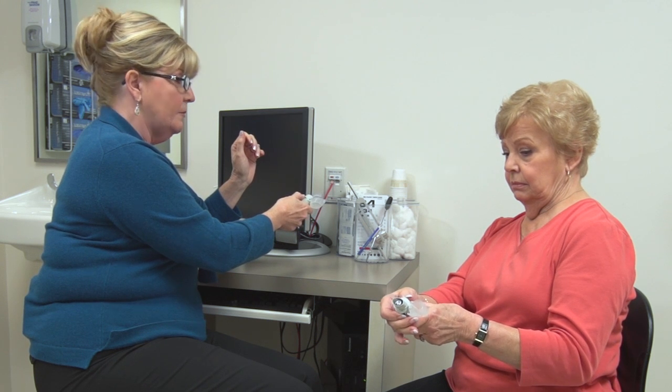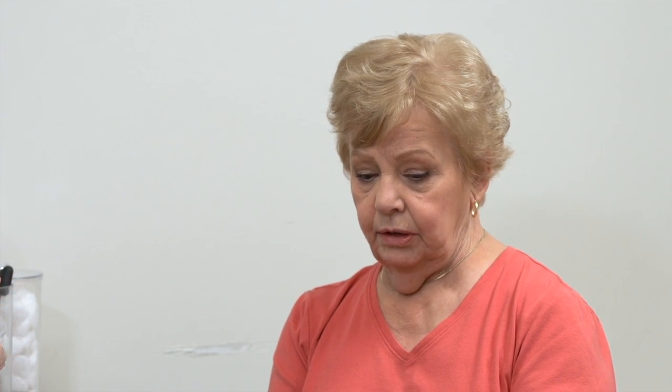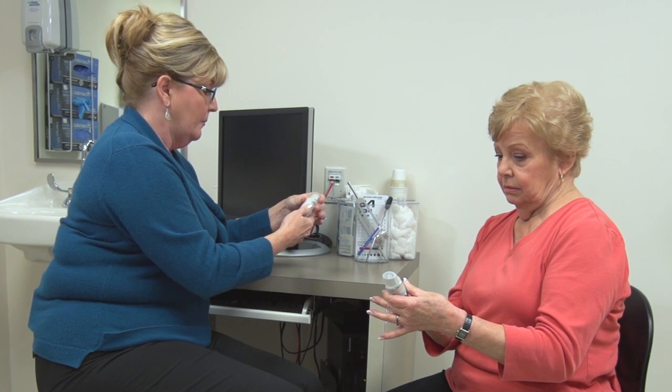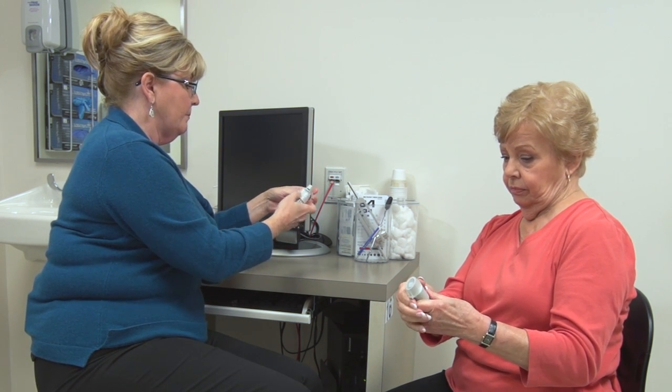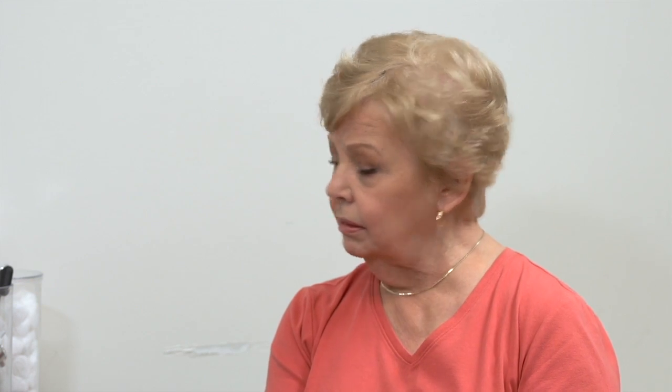Press the gray lever on top to release the mist — you can see the mist come out. The first time you prime the device, you need to do this four times. When patients first load the medicine into the Respimat, and if they have not used the device for more than 21 days, they should prime the device four times. However, if a patient has not used the device for more than three days, they should prime it only once. This ensures the patient will actually receive the medicine appropriately.